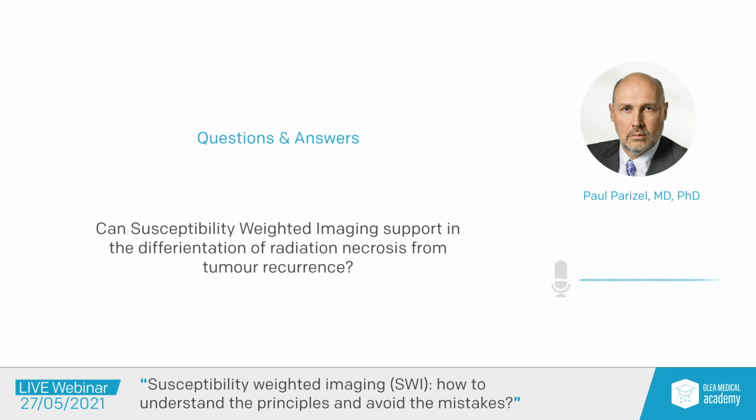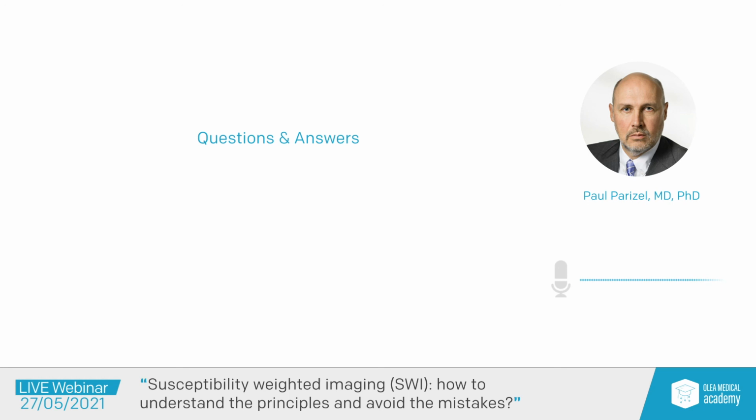Very good question. I have to admit that I do not know the answer to that. I would have to look that up. Okay. And one last question before we release you, everybody, is you mentioned the potential advantage of quantitative susceptibility imaging. What are the limitations to its clinical implementation?